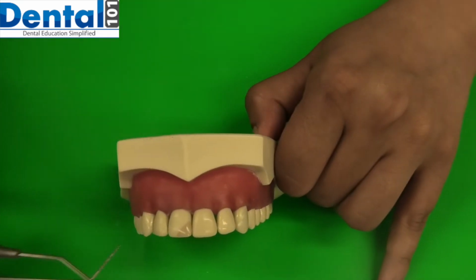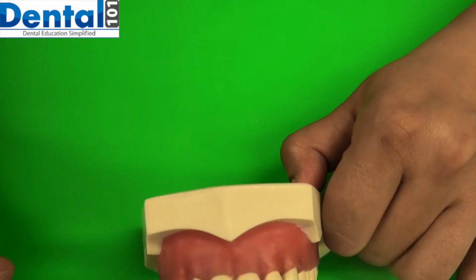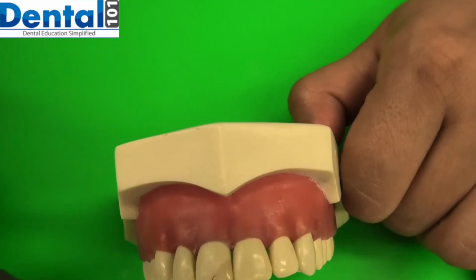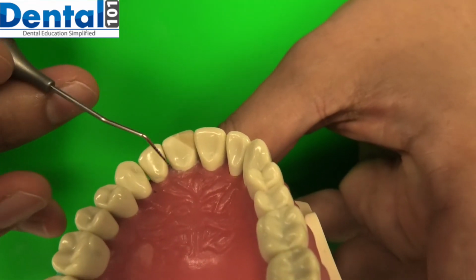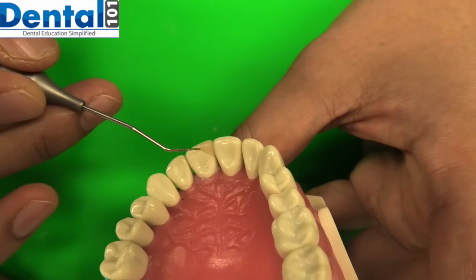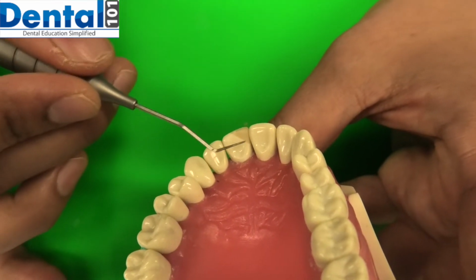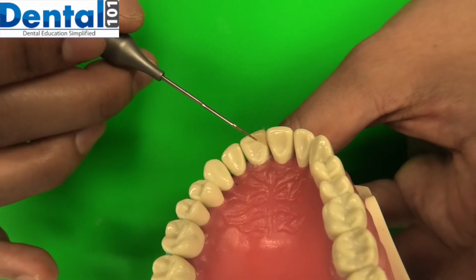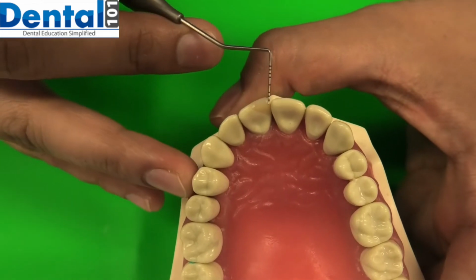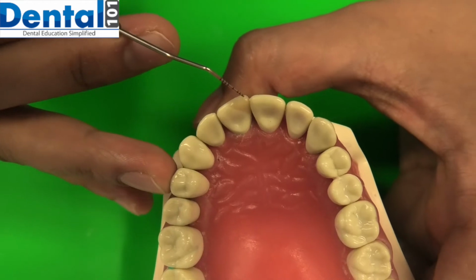All right. On this restoration, you can see that from the buccal side it is highly polished. I can't see any roughness on the buccal surface. Now I will show you the palatal surface of this restoration. The palatal surface is also highly polished. There is no roughness even at one point. So it's highly polished, and the incisal surface of this restoration is also polished.